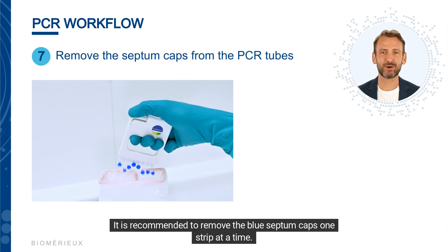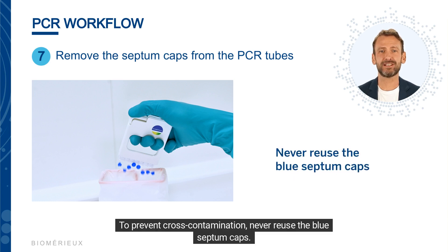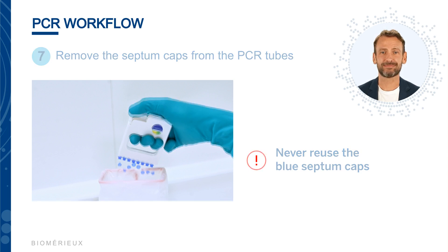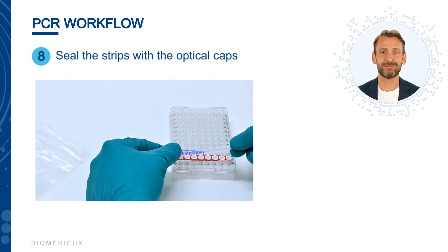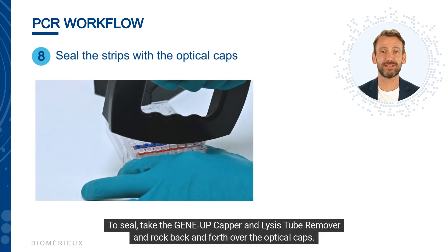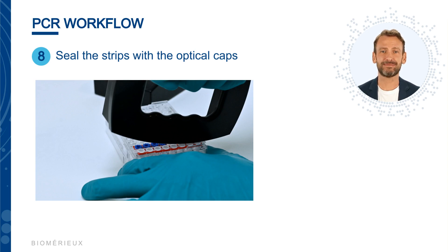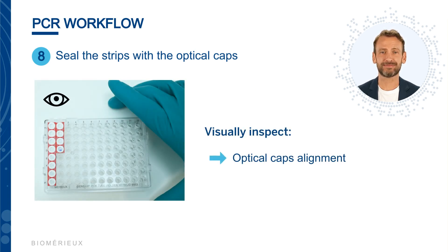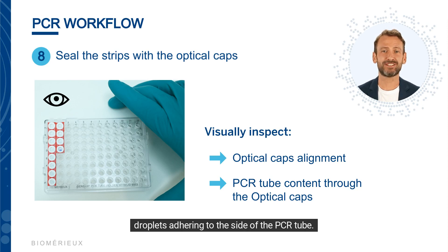It is recommended to remove the blue septum caps one strip at a time. Using the GeneUp D-Cap-Up, insert the hooks into the septum caps and gently rock back to remove them. Discard the septum caps into the biohazard waste container by pressing the button of the D-Cap-Up. To prevent cross-contamination, never reuse the blue septum caps. Once removed, seal the strip with the optical caps using the GeneUp capper and lysis tube remover, rocking back and forth over the optical caps.